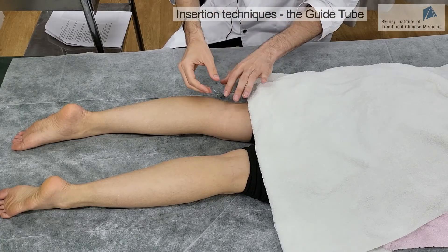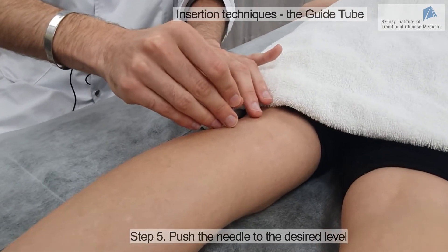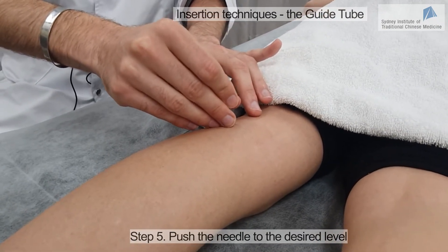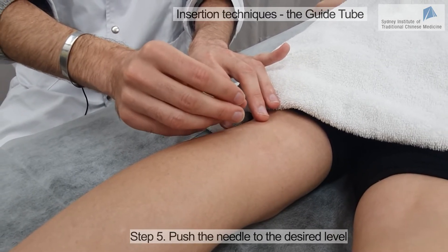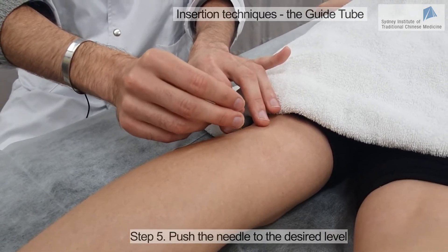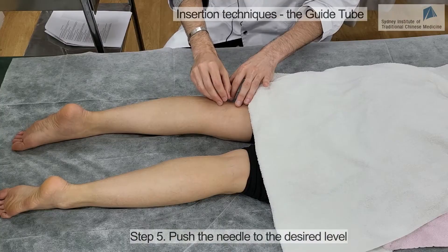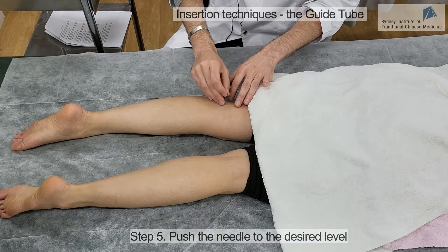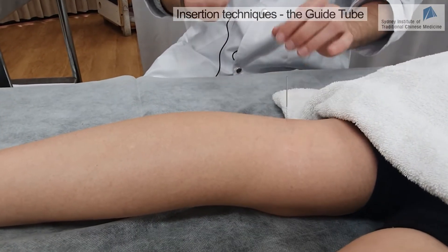Now the needle is inserted inside the skin, and I have time to slowly insert it deeper inside the tissues to make sure I'm in the correct place. Do you feel anything? No. Let's adjust it a little bit so we're sure we are in the correct place. Yes, okay — that's it, we are here.